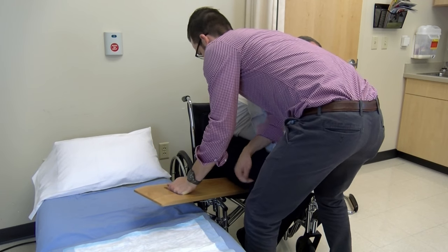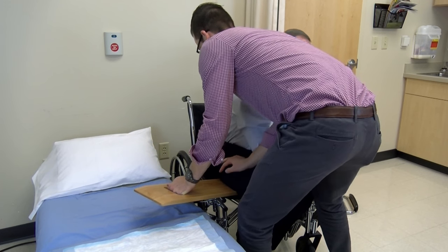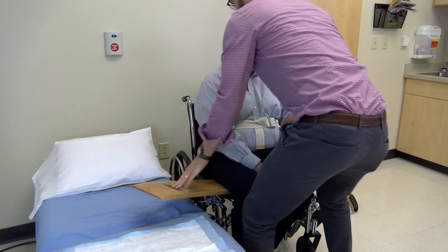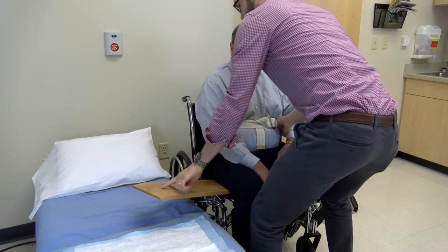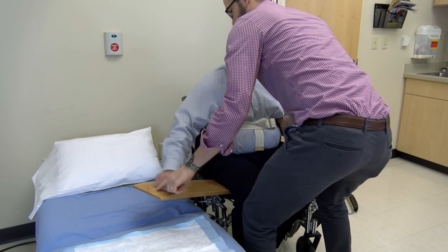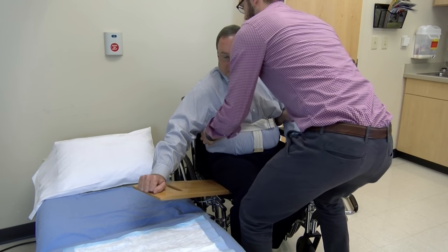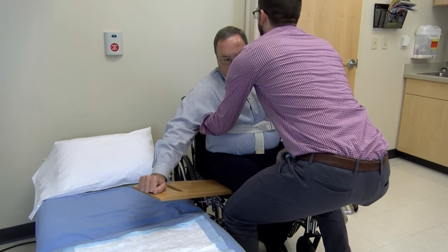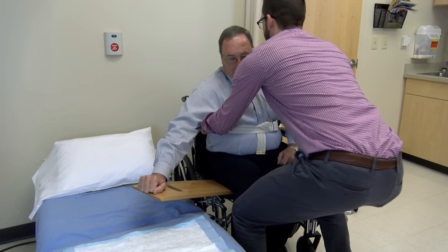Slide the sliding board underneath the leg, ensuring that it is firmly placed underneath the patient. Have the patient redistribute their weight so that one leg is on the sliding board and one is on the chair.